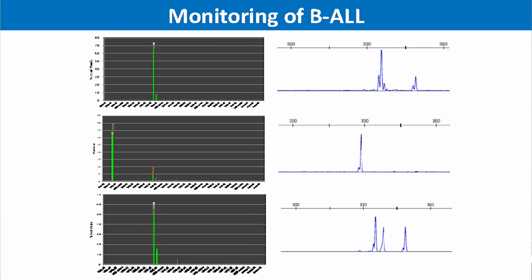So these patients with B-ALL, not only can we monitor the disease, but we also can monitor the CAR T cells and how they start going down or up after they are treated with them. So it's a very helpful assay to do both things. For this patient on the subsequent sample now has no CAR T cells and has the same clone that they had before, but in addition to that clone, they have an additional clone, which you can see here.